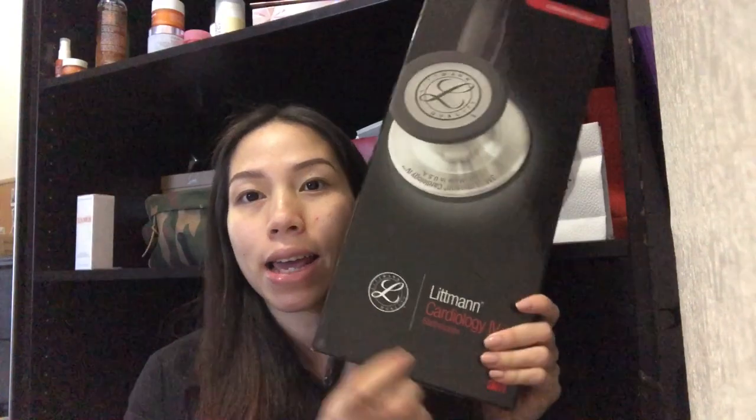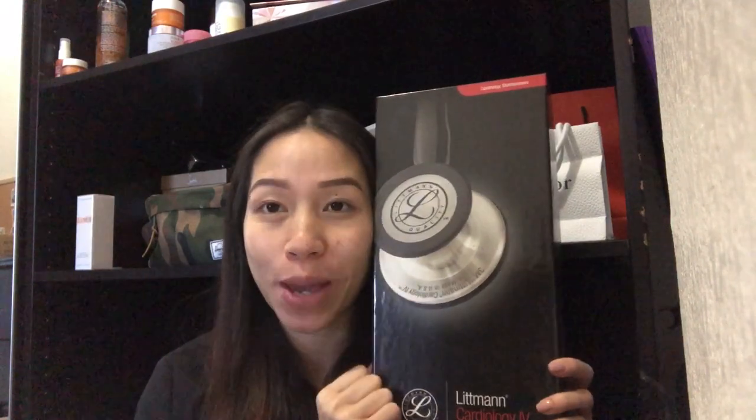So a while back when I first started nursing school, I got a Littmann Cardiology 4 as a gift for getting into nursing school. I loved it — it worked really well. As a nursing student you don't necessarily need it, the classic one is fine, but I figured it would last me throughout my whole nursing career. Unfortunately, my car got broken into, my work bag was in there, and it was stolen. All I have left now are the accessory parts.